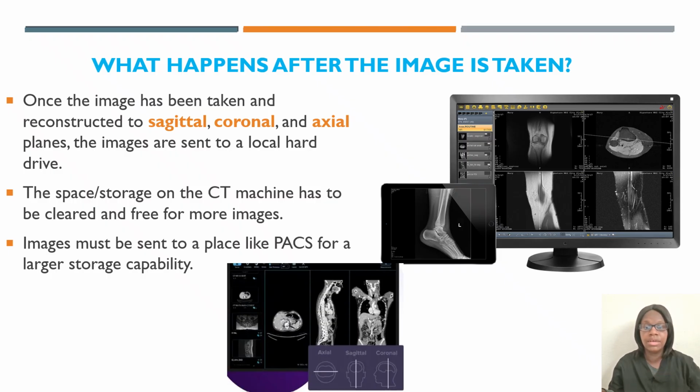So I just leave that up to the technologist that works there full time to get rid of those images. So one day I was working and the machine was slowing down a lot during the scan, and then in between patients the tech just started deleting the images, or they just started telling me, yeah, you can go ahead and delete them, start from the bottom and then just work your way up.